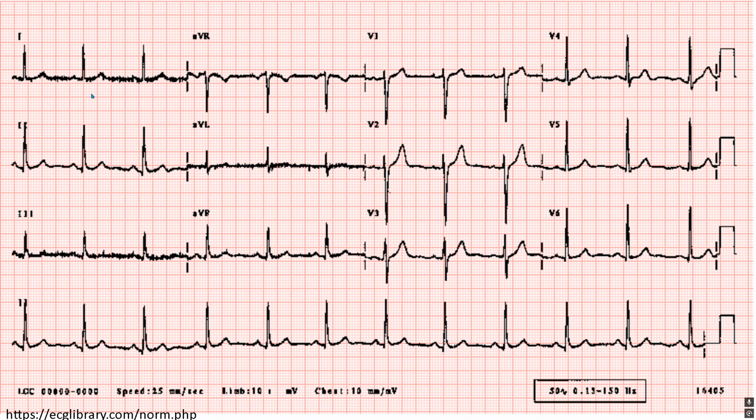All right. Now, like I said, number 1 is to come up with a system. Number 2 is to remember what a normal EKG is supposed to look like, right? Because that's how we identify pathology. How is this EKG different than normal? How is it different than their baseline? And what does that mean?